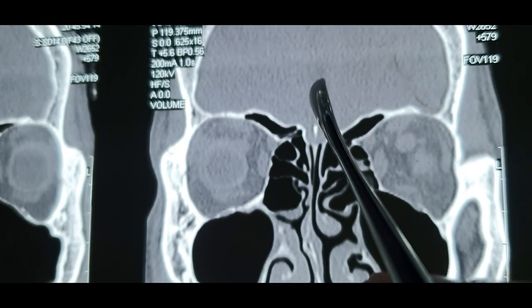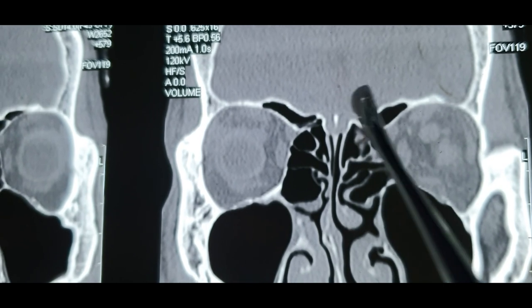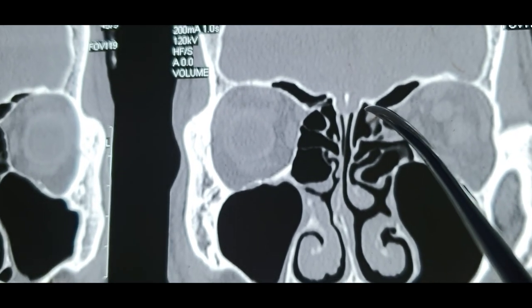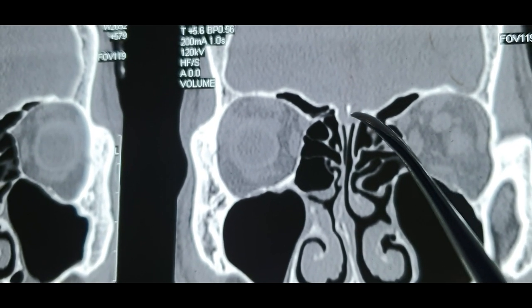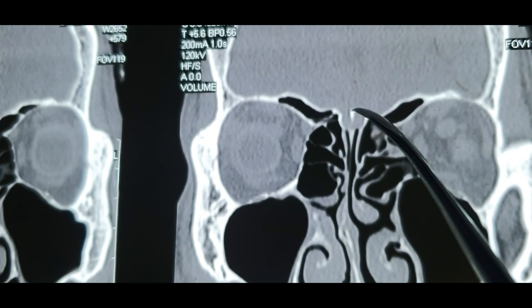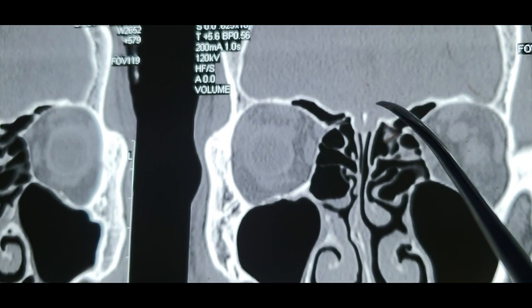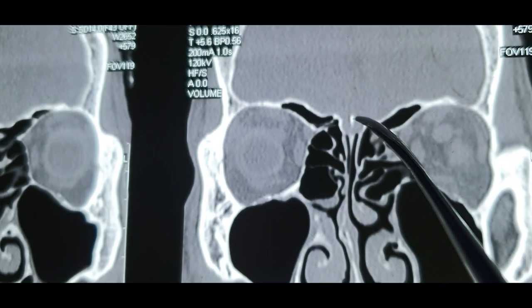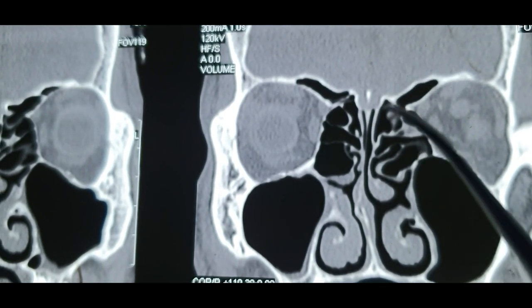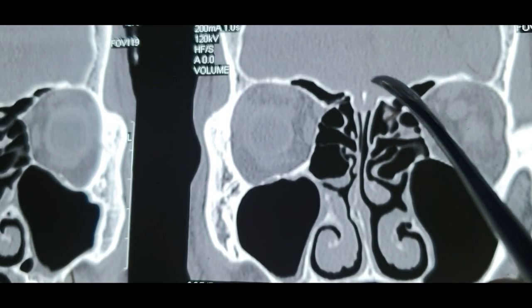Now, this is the midline. There is the falx cerebri, as we all know, the falx cerebri lies here dividing the two frontal lobes. This is the falx cerebri. So, this is the artery leaving from the canal entering into the cranial cavity here. Now, the moment it enters or pierces through the lateral lamella, it gives off a branch into the anterior aspect of the skull base, into the meningeal layer, that is called the anterior falcine artery, also called the anterior meningeal artery, also called the anterior falx artery. These all are the different names of the same artery branch, which supplies the falx cerebri.